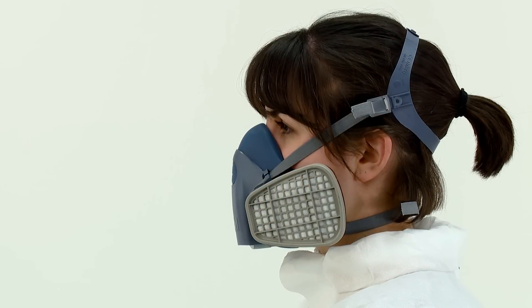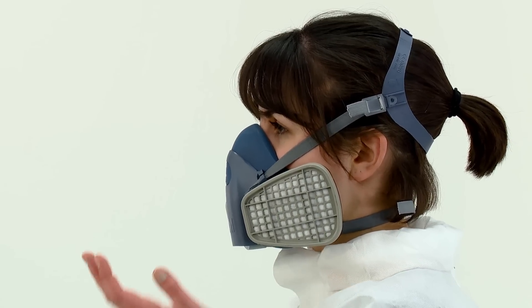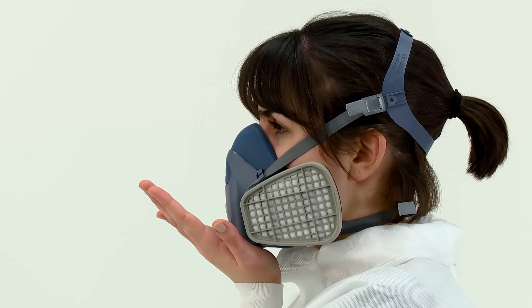If it does not and you detect air leaks at the seal, adjust the fit, taking extra care with the tension adjustment of the straps. Then repeat the fit check. If you cannot achieve a proper fit, inform your supervisor and do not enter the hazardous area.